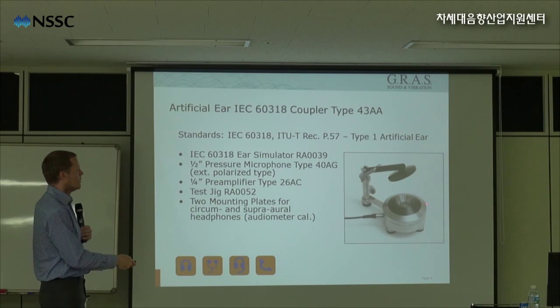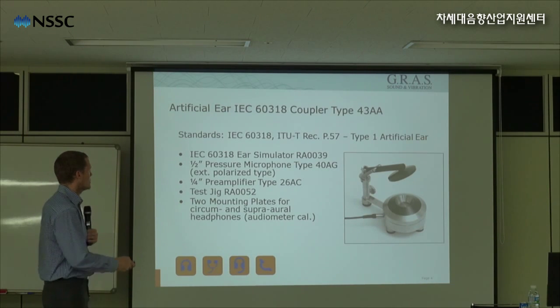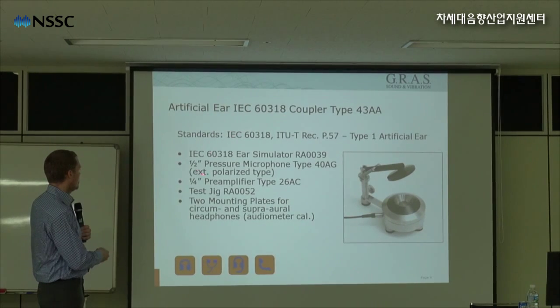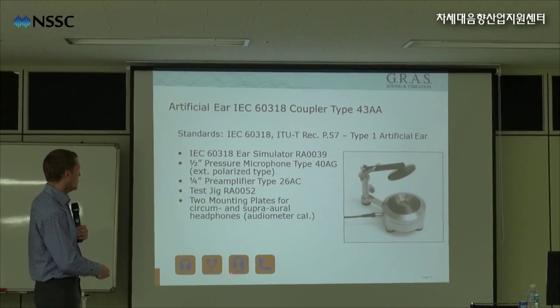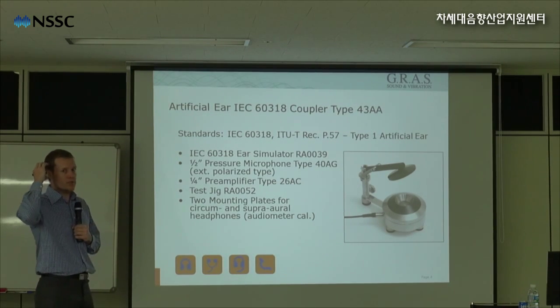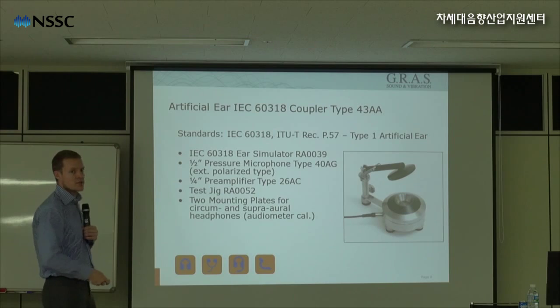So this is a mechanically designed ear simulator to test according to IEC 60318. It is designed to test headphones. Insert phones are also possible. We can test the speaker inside the headset, and you can also use it for testing telephones.